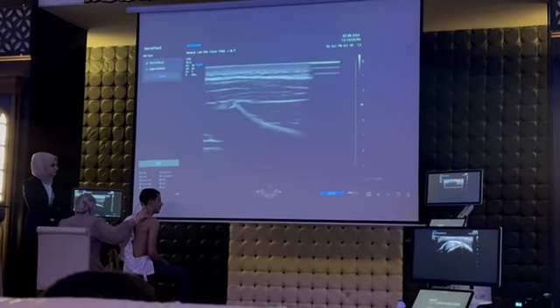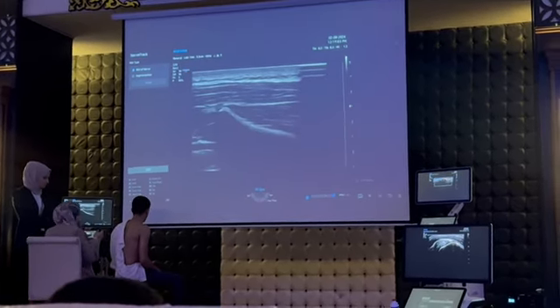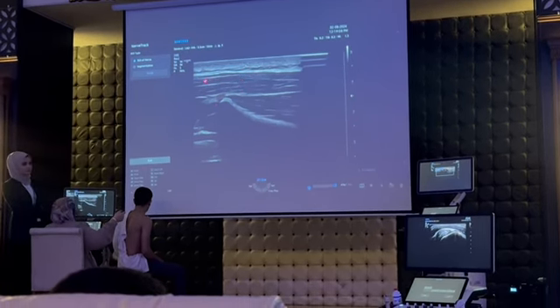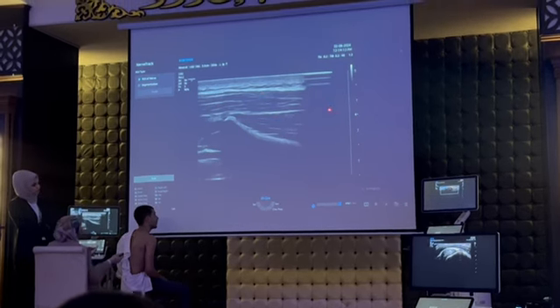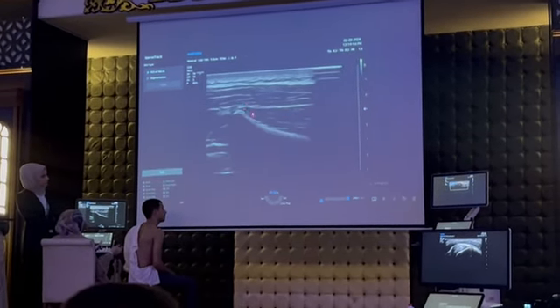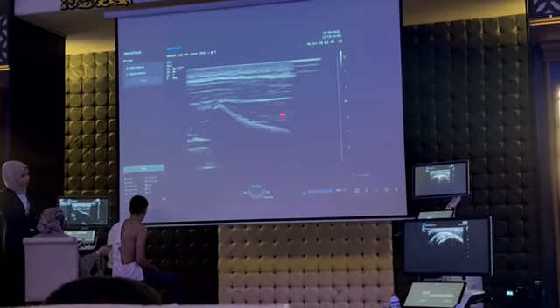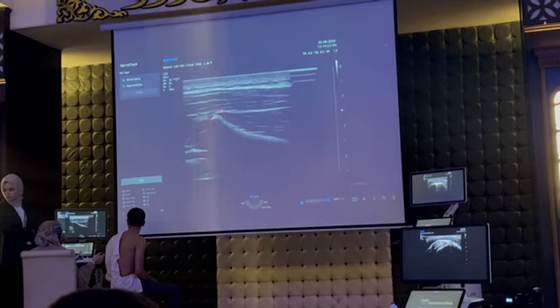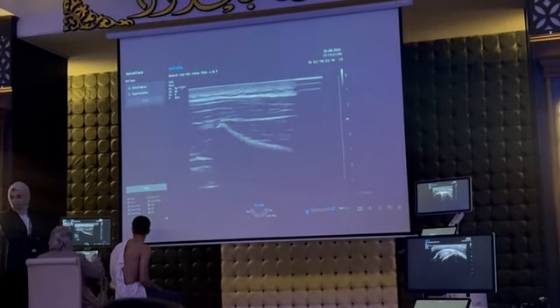You see, this is the trapezius muscle. The bulkiest muscle in the back of the shoulder is the trapezius muscle. I see this, the fish-like appearance from medial. This is the supraspinatus muscle. So I begin examining from medial, which is fish-like, and continue lateral till the thickness increases.